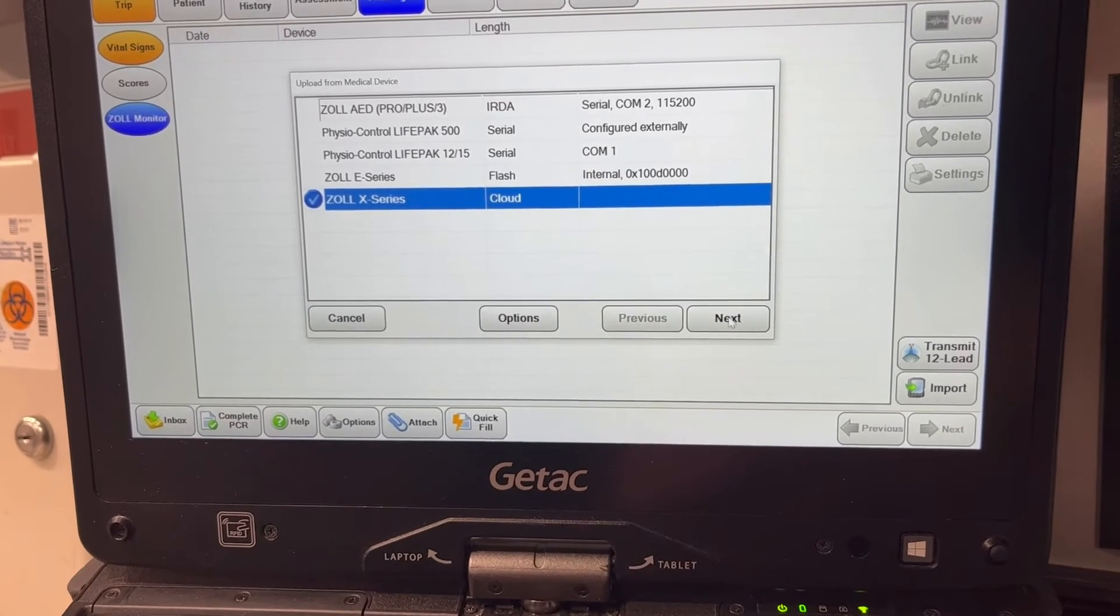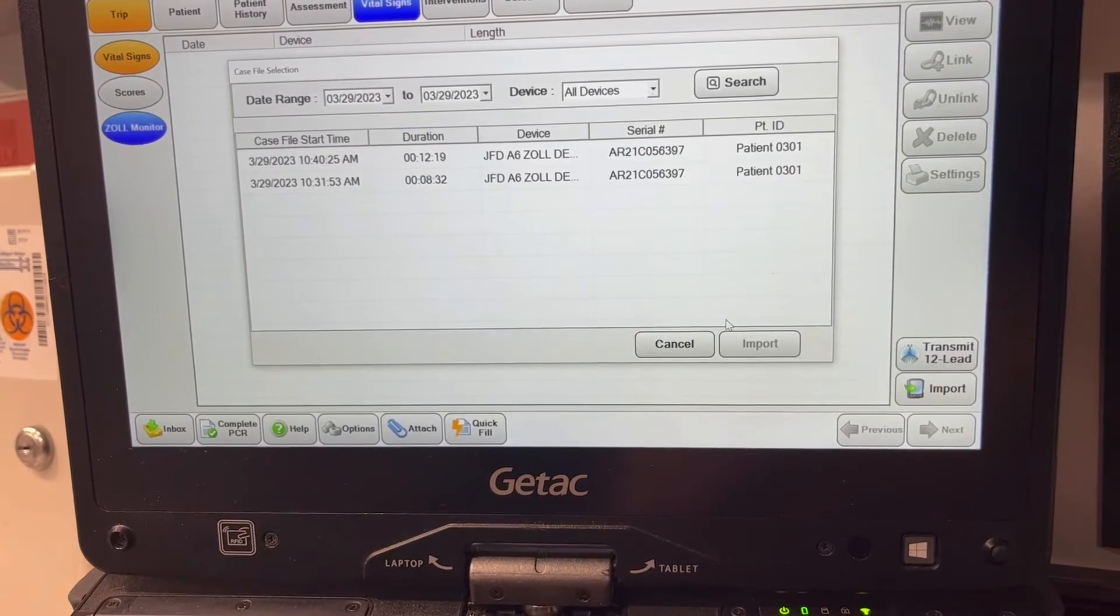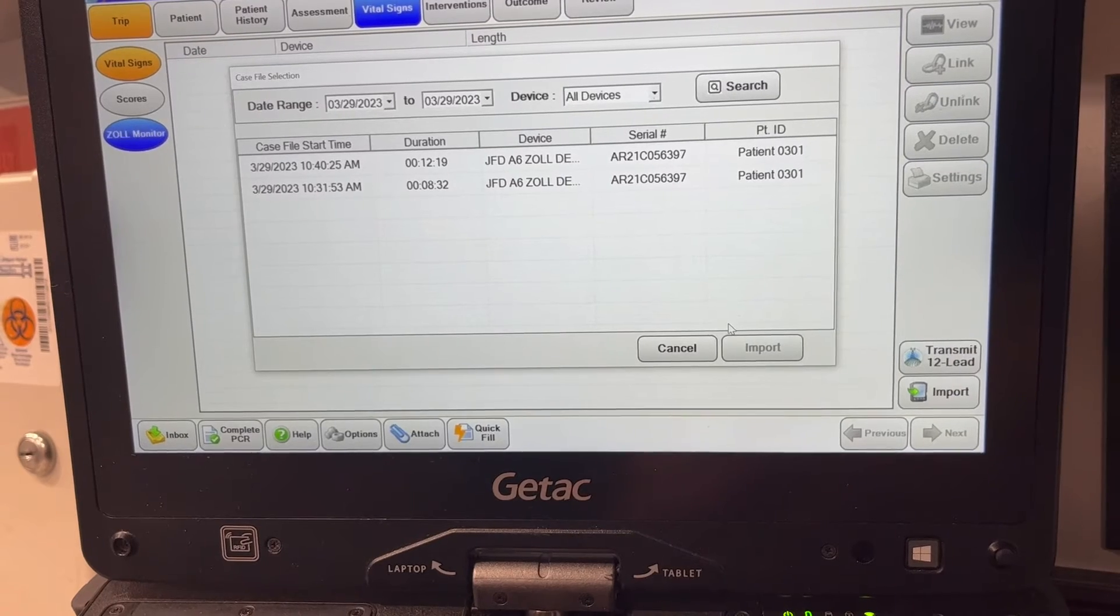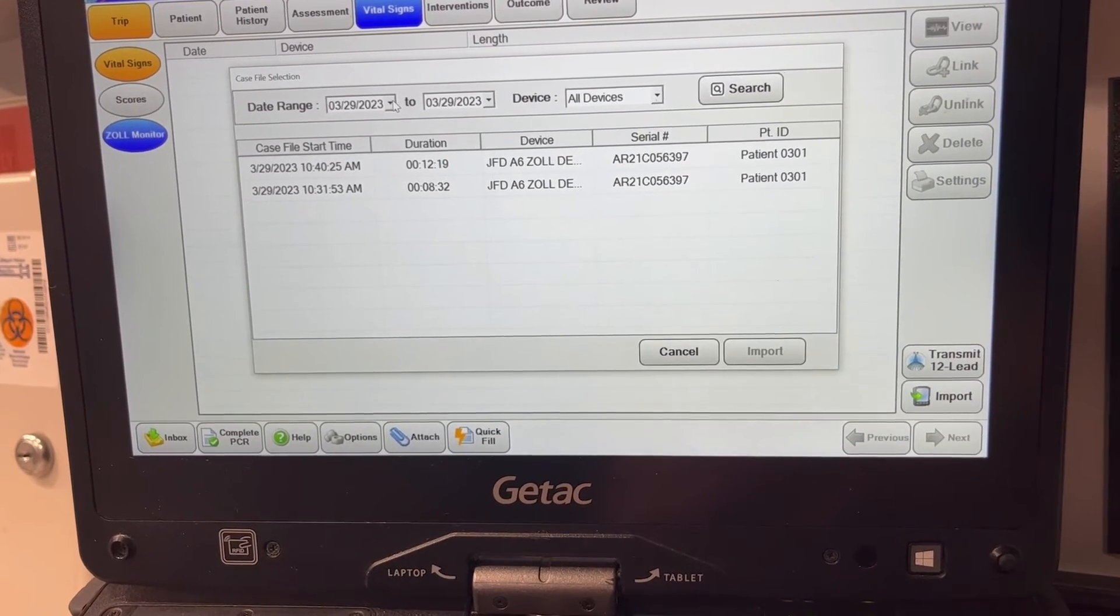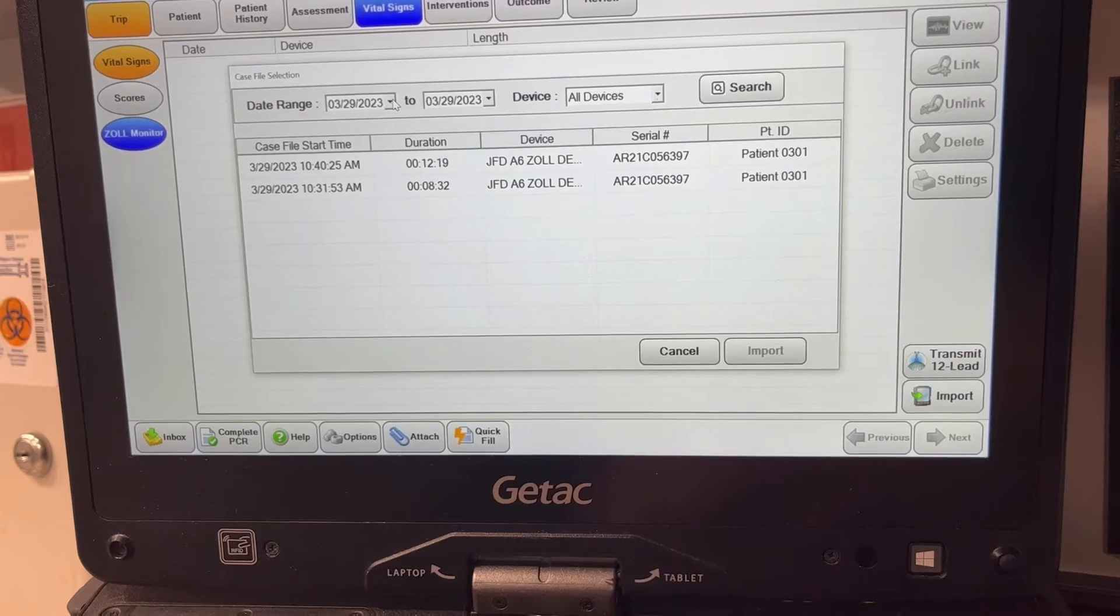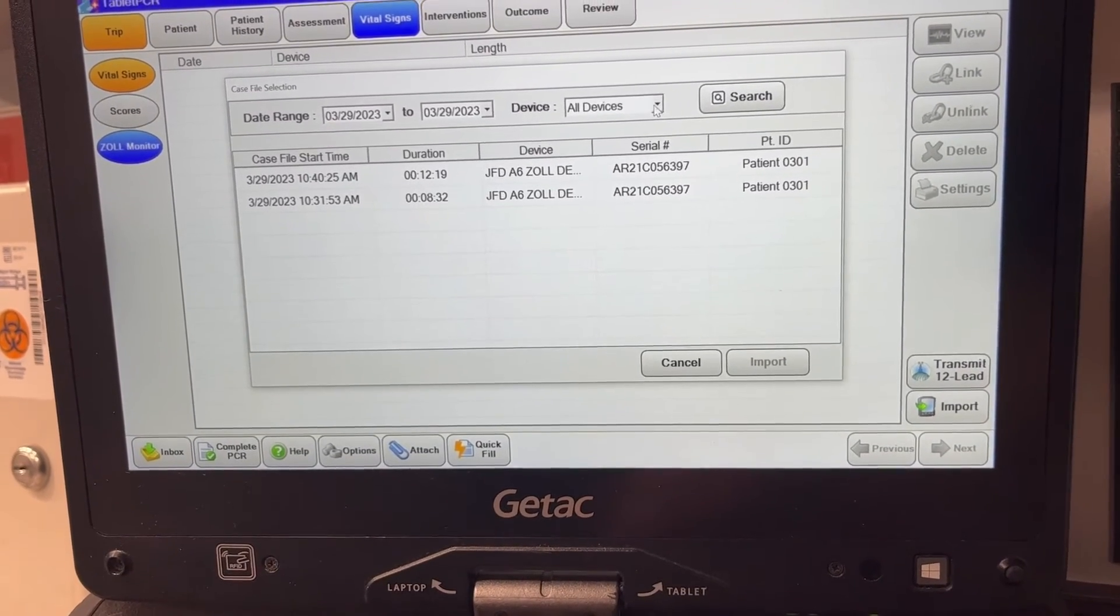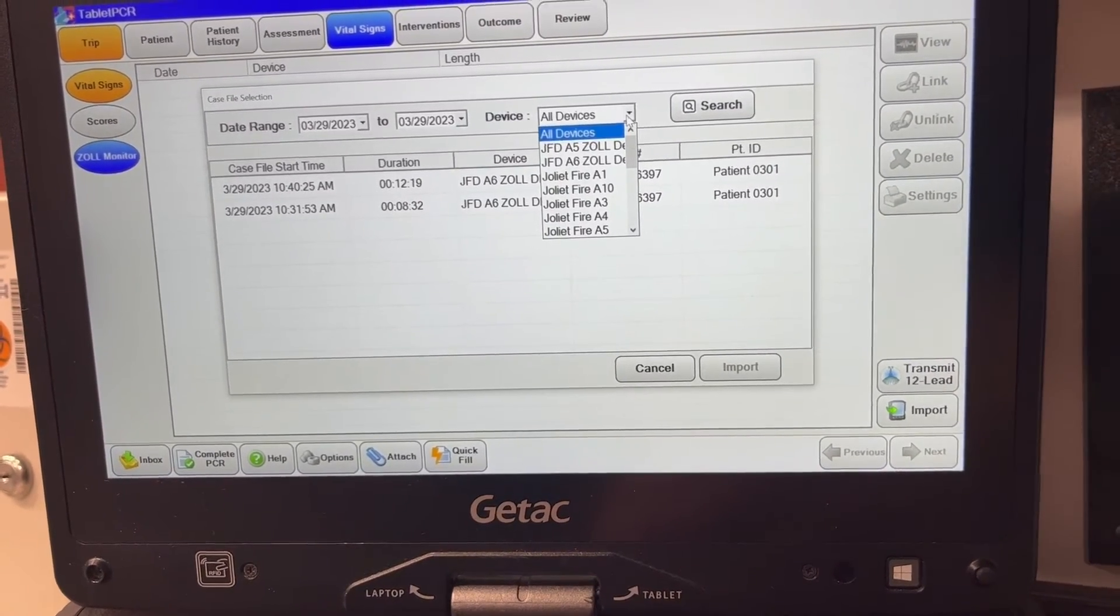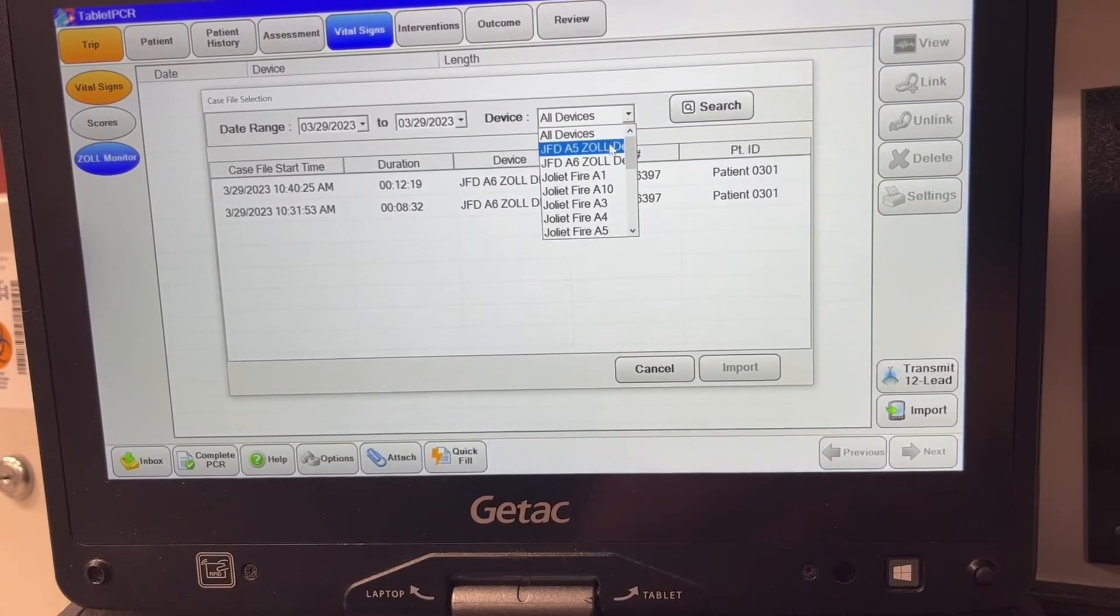It should say Zoll cloud, hit next, and then it's going to drag in any available case files. If it's not the exact date that you're currently working on, you can select a different date range. You can also pull, instead of all of the files from Joliet Fire, you can pull just from the vehicles that you're working on that day.